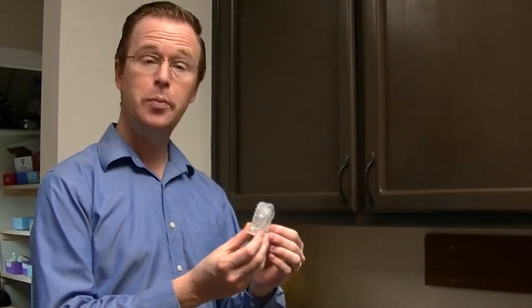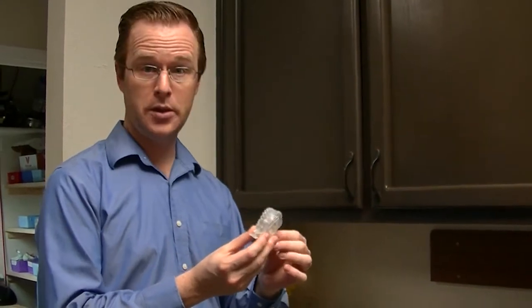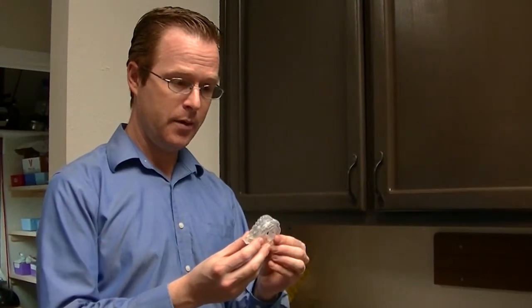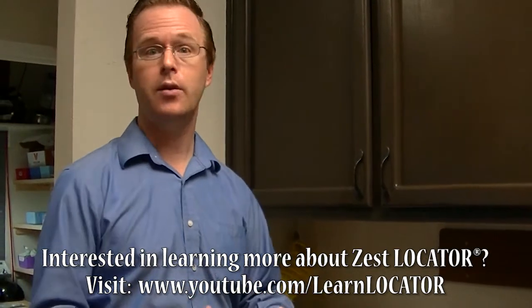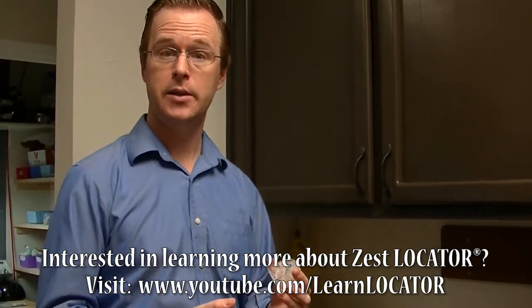What I've done here is I've duplicated this denture for the purposes of a laboratory exercise to teach dentists how to pick up a locator, or a locator over-denture type of attachment system.